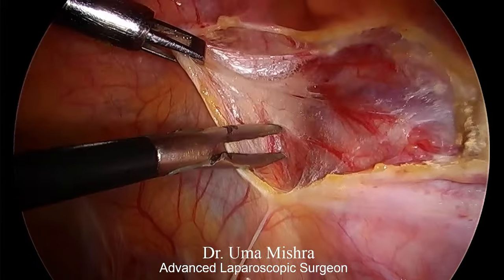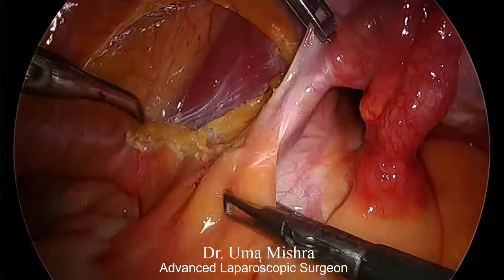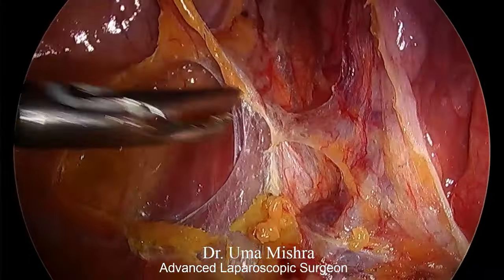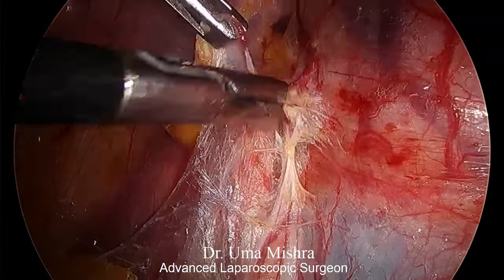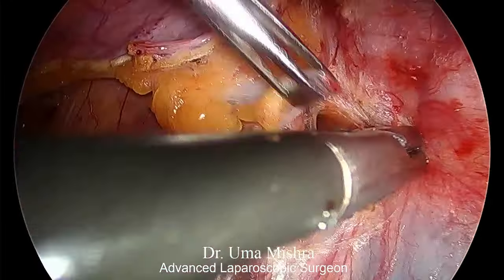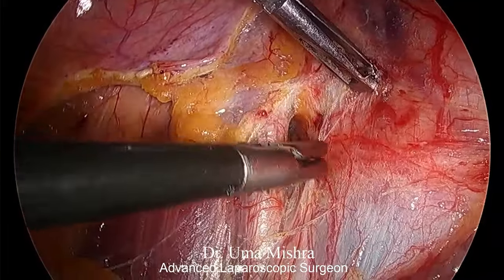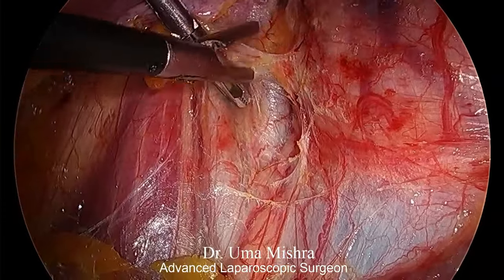So the first step in such cases is to visualize ureter, as the size of fibroid is huge, and when we dissect the myoma we should know the position of ureter. So we have cut round ligament over here, and you can see the myoma is almost filling whole of the pelvic cavity. We have only very little space to work.